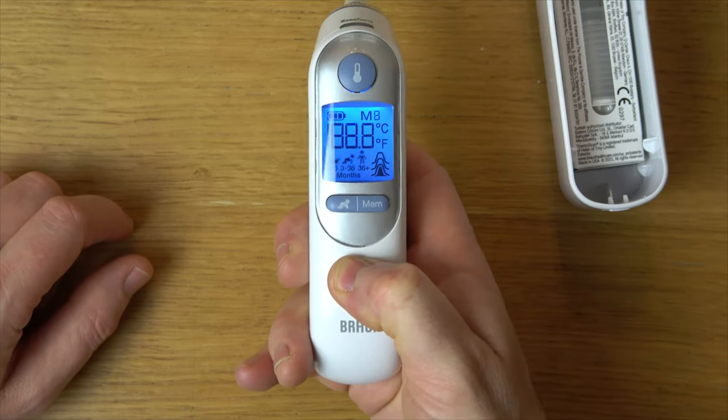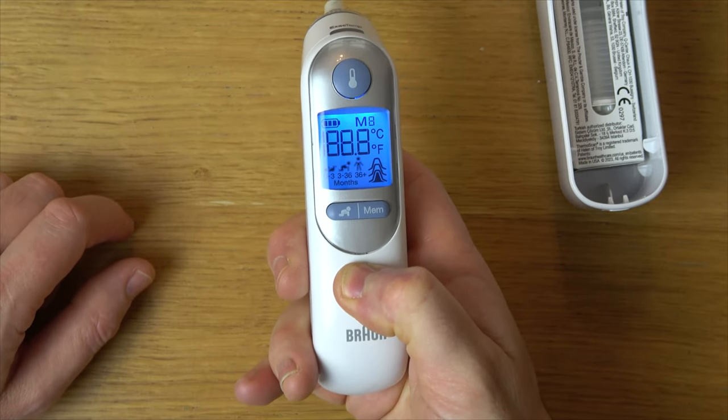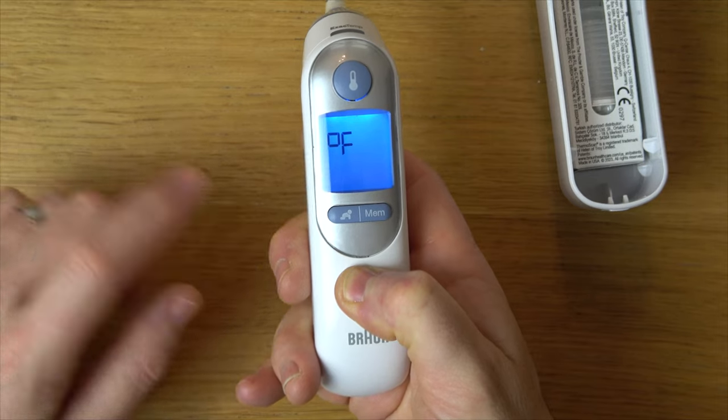So let's hold down the power button now. I'm going to keep holding it down, still holding it, and now you can see that's Fahrenheit.